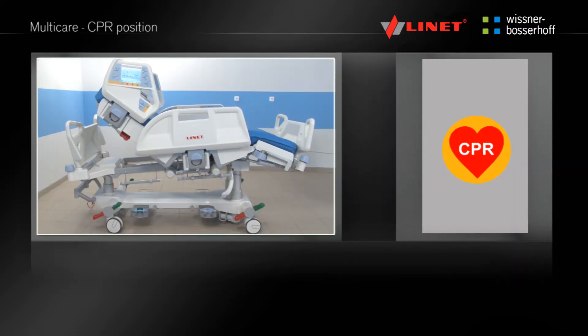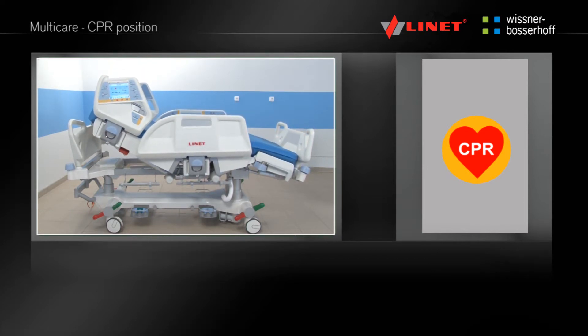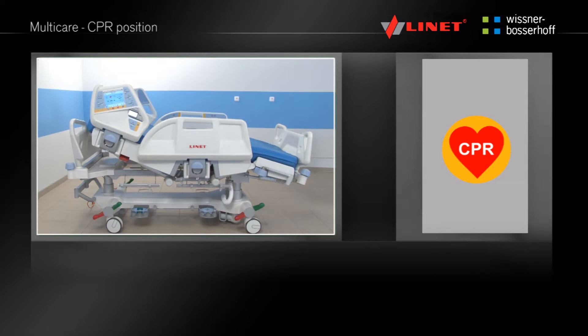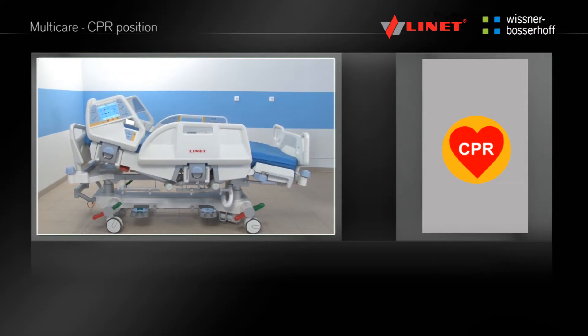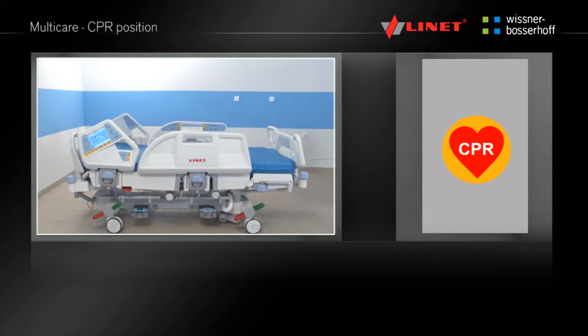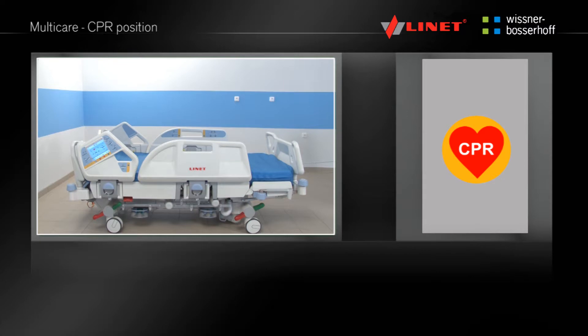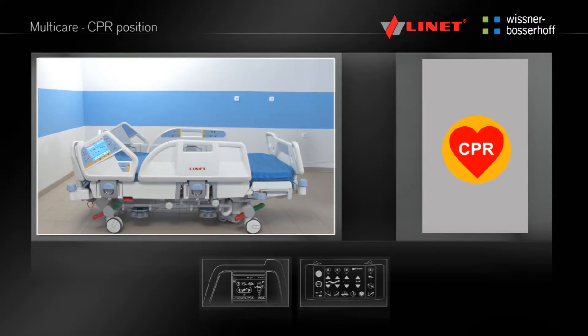Press and hold the pre-programmed function button until the CPR position is reached. The Go button is not required for this position. The bed is flattened and positioned to the lowest height so that the patient can be resuscitated. This function is located on the integrated side rail controls and the Supervisor panel in the green area where the pre-programmed functions are located. The CPR position can also be activated manually.